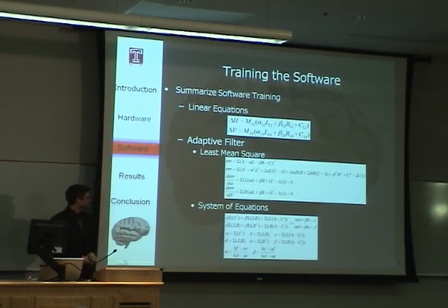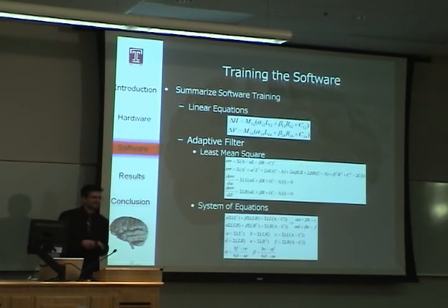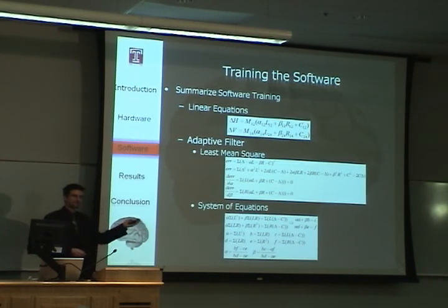Now this slide is kind of a recap. This is what we're actually looking at implementing inside C, or we did implement inside C. The only thing that's never really discussed here is the software itself, and one of the reasons is it's probably more boring than what I talked about already. The only thing that's happening inside C is we're implementing these particular equations, and it's being done in a multi-threaded C environment.